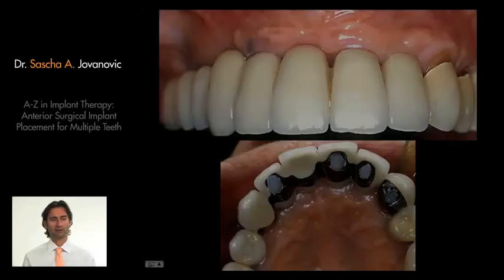And here the final healing. You can see the palatal area where I removed the connective tissue, normal healing. And you can see the buccal, how I've improved the thickness, have maintained keratinized tissue, and I really have an optimal treatment.